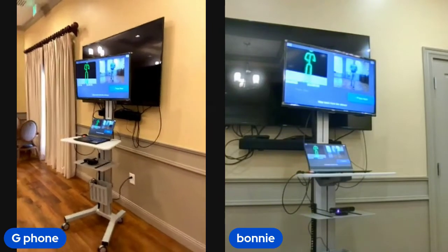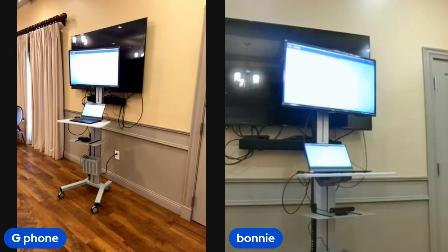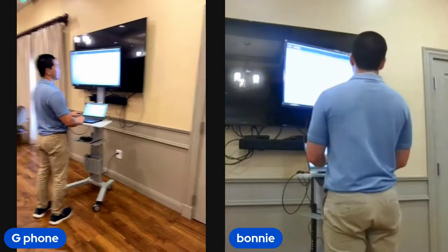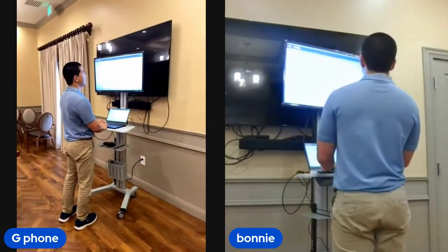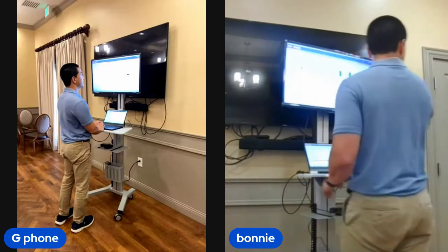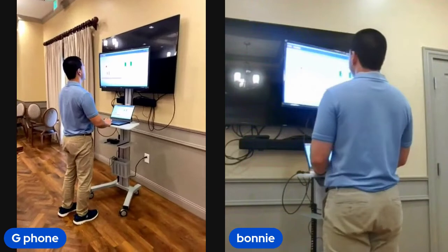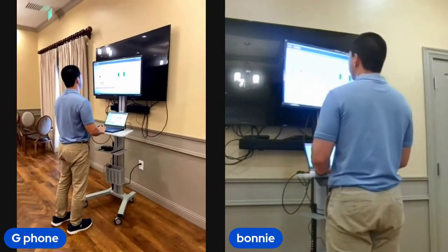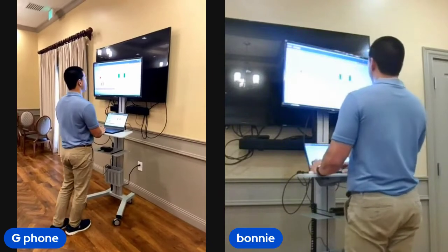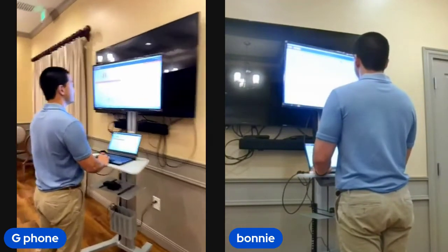Test completed. Press next to finish the test. Next. On here, I can write, as a therapist, some comments on how they did. Say they opened their eyes or something. I can write that, or if they had any other adverse events. Can you see? Is this one on or no? They're both on. Okay, well, you can see their score here. I think maybe Billy will go over this a little bit, but you can tell if they're kind of below average or below the median. You can see how far they've swayed or shifted to one side.